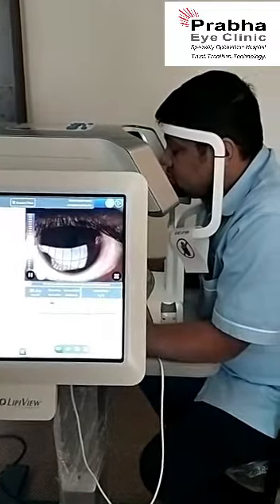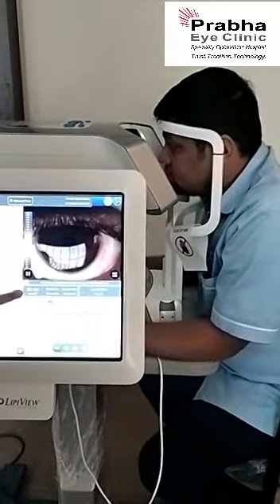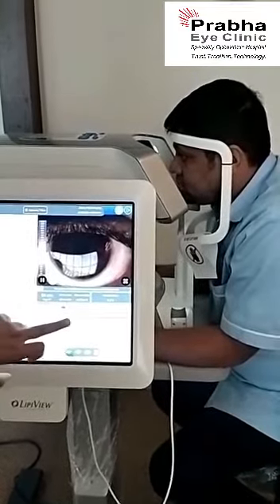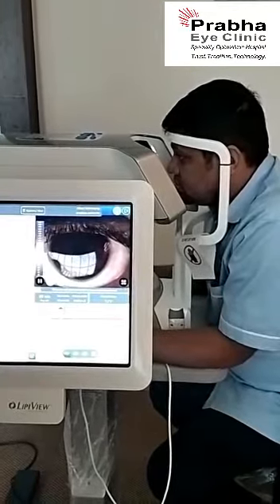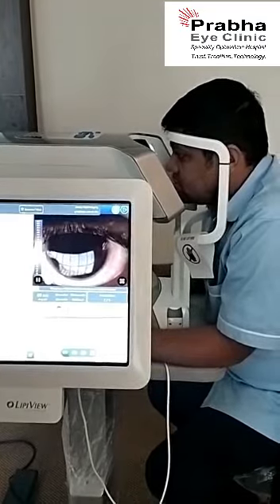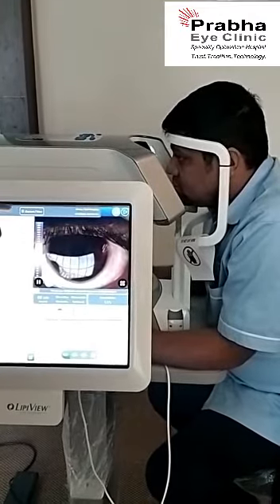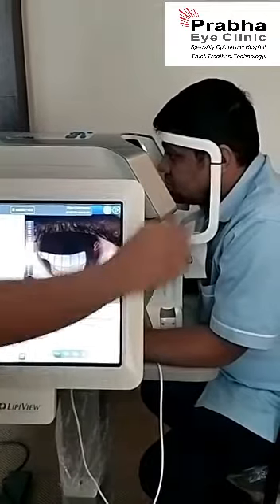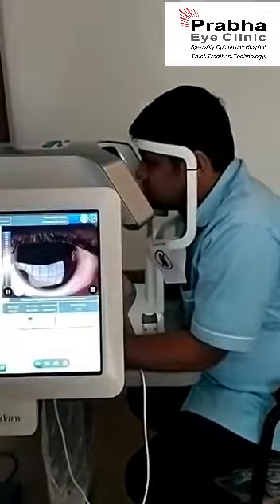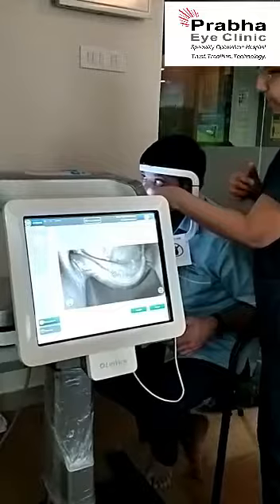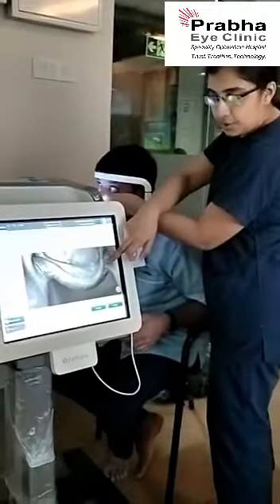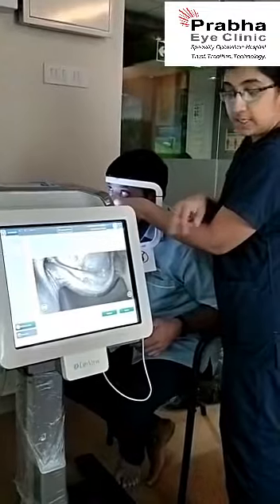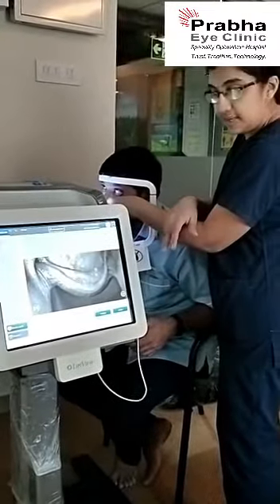We can analyze the results in which the average lipid layer as well as the thickness of the lipid layer will be elucidated. We can also analyze the structure of the Meibomian glands, which are the oily glands, by examining their anatomy with this apparatus. The same analysis can be done for both the upper as well as the lower lid.